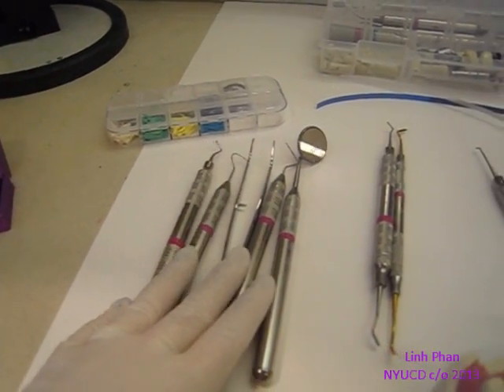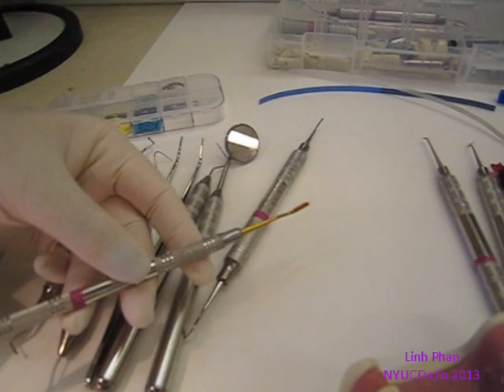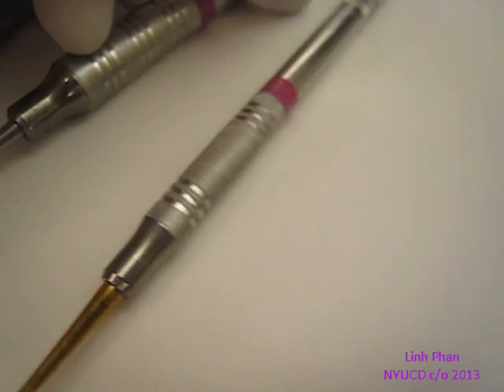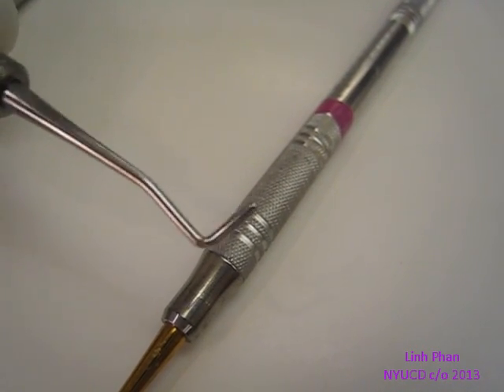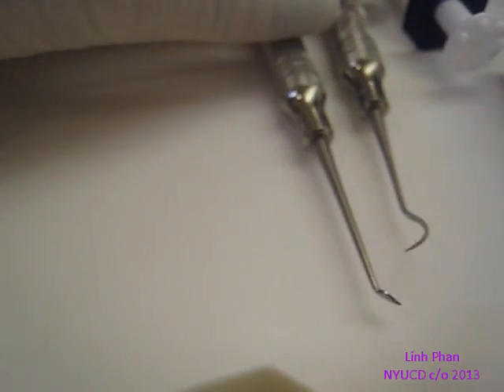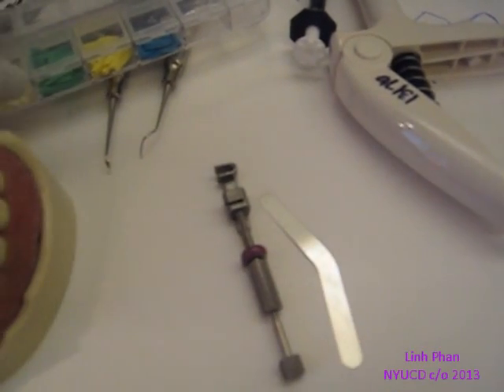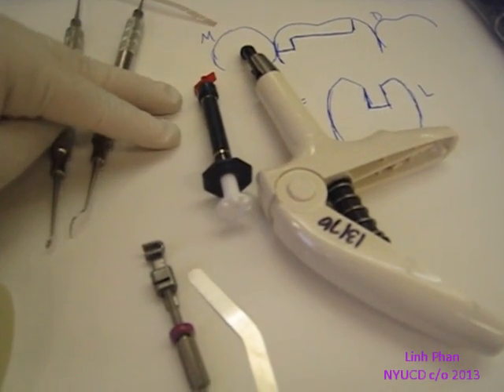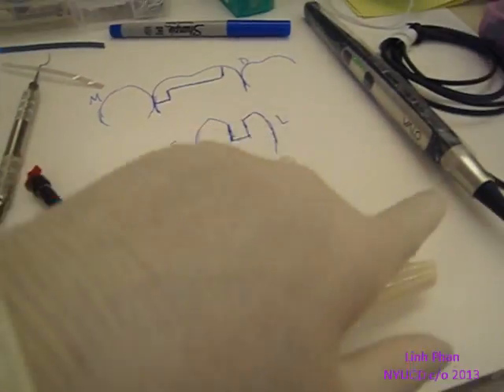You want to start with your basic setup. There are two instruments in your kit: you have your plastic instrument, which is gold in color, and then you have another one that has a similar sort of shape on one side and a plugger sort of shape on the other side, and this will help you put your composite in. I also use an Interproximal Carver and the Cleoid to clean up a little bit. You also want your Toffelmeyer and your matrix band. You want the wedges so that you can make sure there's no overhang, and then you want your composite. In a real tooth you would need etch, but here we're just going to use bond and composite in the composite gun. And of course, your curing light.